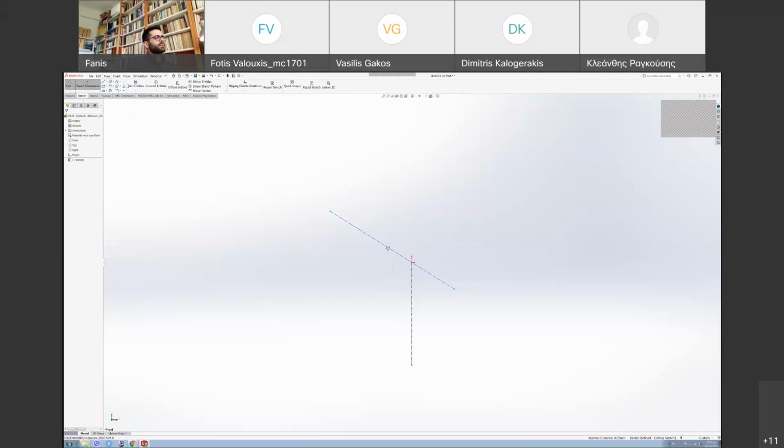Now I'm gonna put some dimensions. These are indicative, but they're not actually dimensions. They might be a bit different from your 3D model, but it's okay. Don't worry about that. So I'm just gonna put this 98.